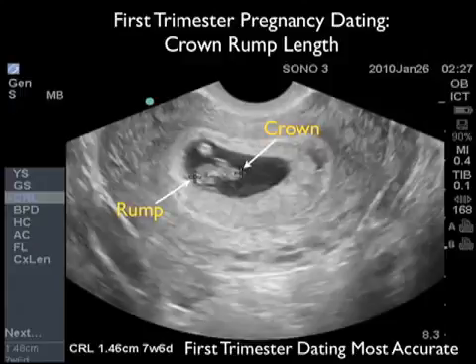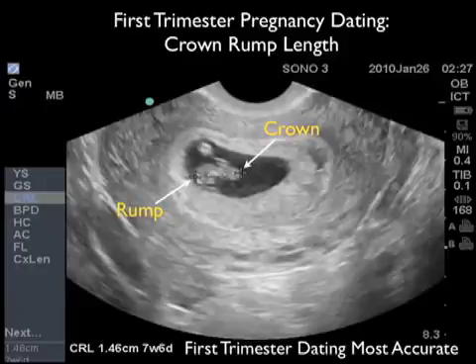Now, by selecting crown rump length in the software package on the ultrasound machine, we'll get an assessment of gestational age, which we can see here towards the bottom left, 7 weeks and 6 days. As first trimester dating is considered one of the most accurate during the entire pregnancy, it's nice to print this image out and give to your patient to take for their follow-up visit with their OBGYN.